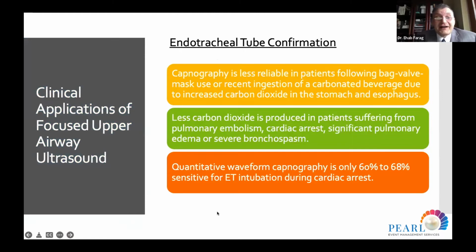So that is very interesting about using ultrasound for confirmation of the endotracheal tube. Capnography is less reliable in patients following bag valve mask use or recent ingestion of a carbonated beverage due to increased carbon dioxide in the stomach and esophagus. At the same time, less carbon dioxide is produced in patients suffering from pulmonary embolism, cardiac arrest, significant pulmonary edema, or severe bronchospasm, so you cannot find capnography. Quantitative waveform capnography is only 60% to 68% sensitive for endotracheal intubation during cardiac arrest.